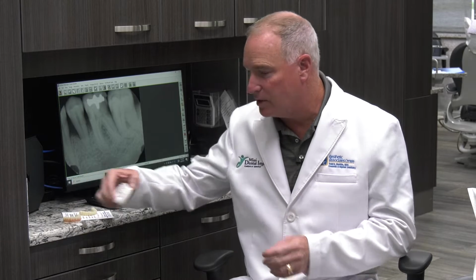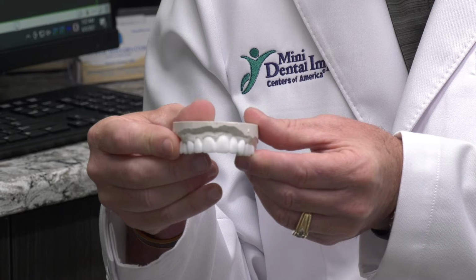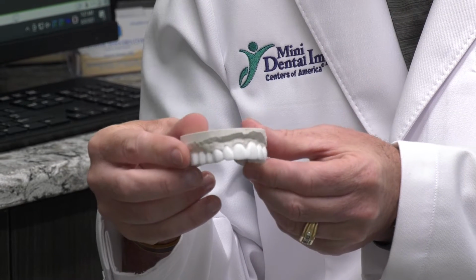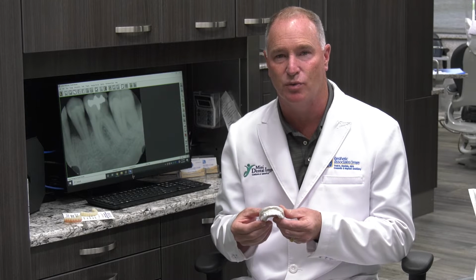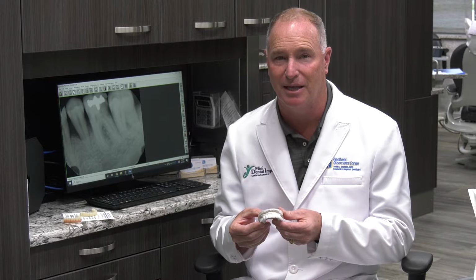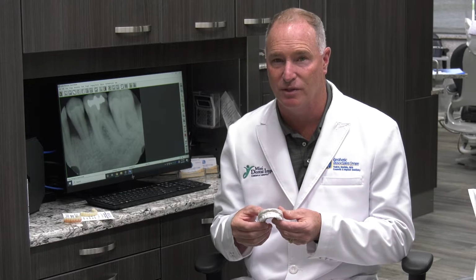The next thing we can do is a diagnostic wax up, which is simply sending in those models and having our lab do a wax up on the teeth or on the ridge so that you can present it to your patient if you so choose, to let them see what the teeth might look like after they're all done. This is an optional step, but in certain situations I like to do this, especially if I have a very particular patient and I think it's going to be a tough case to get a perfect result with.